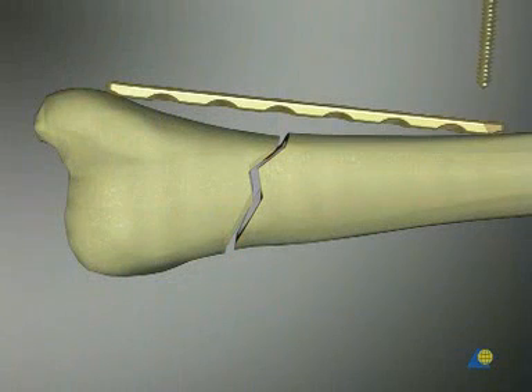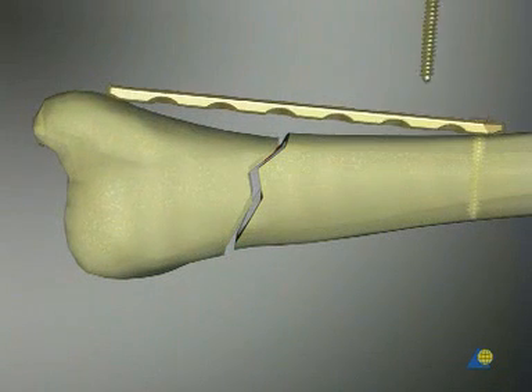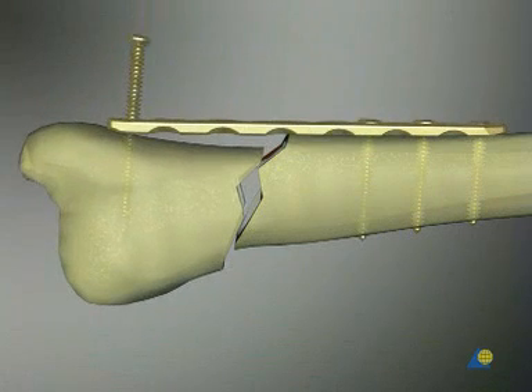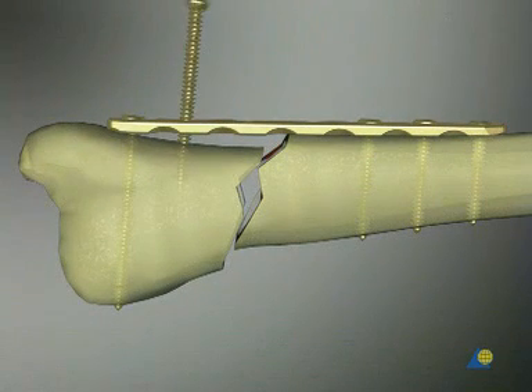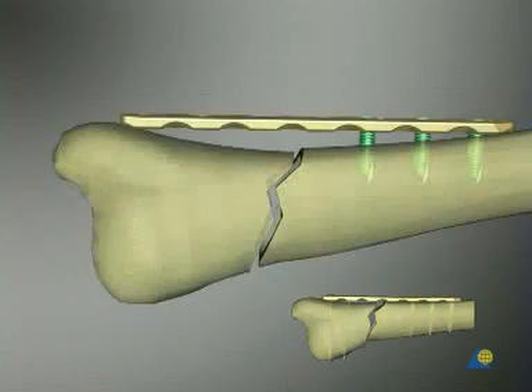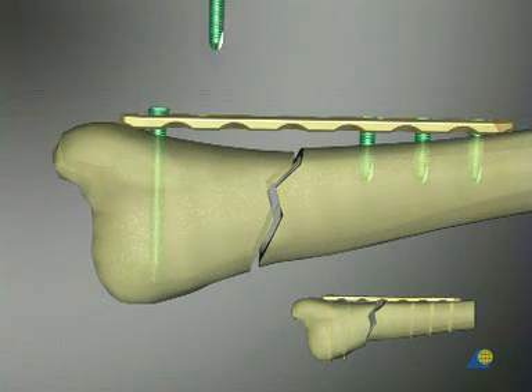With the conventional method using standard screws, inaccurate bending of the plate inevitably leads to loss of primary reduction because the bone is drawn to the plate. This disadvantage does not arise if an LCP with locking head screws is used. The plate does not have to be pre-shaped absolutely anatomically. In addition, the plate is not pressed against the bone, which prevents any damage to the periosteum.